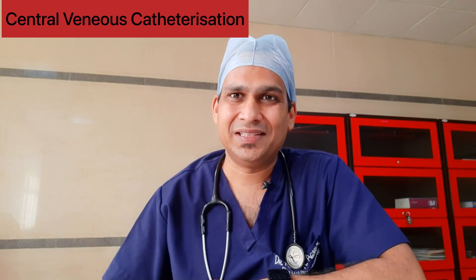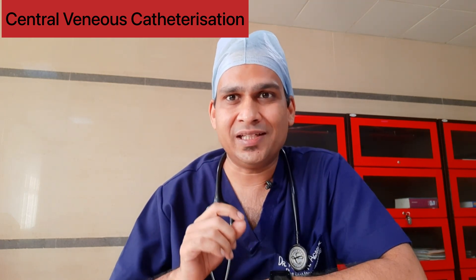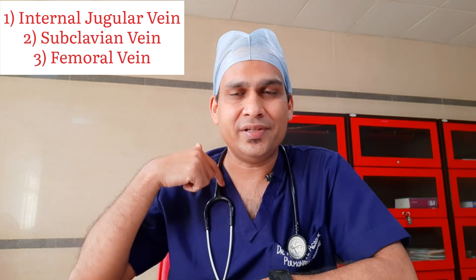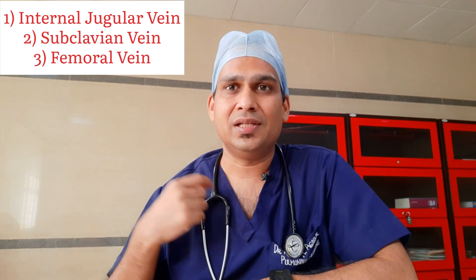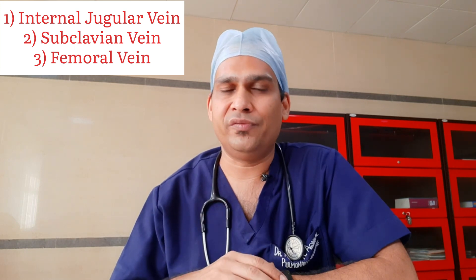Good morning friends. Today we will see a live demonstration of central venous catheterization, otherwise called central line. For the vein we are using: we can use internal jugular vein, we can use subclavian vein, and we can also use femoral vein. Each vein has its merits and demerits.